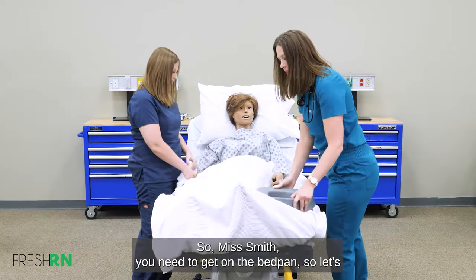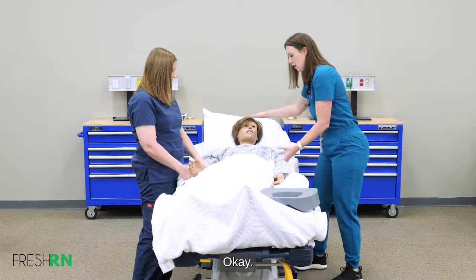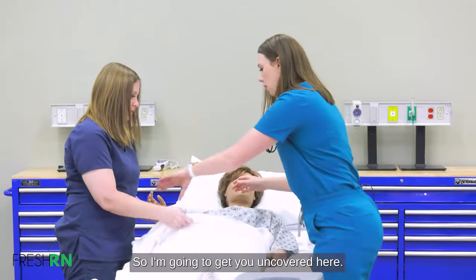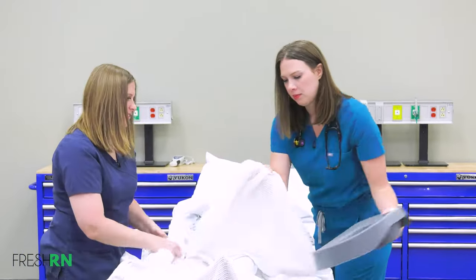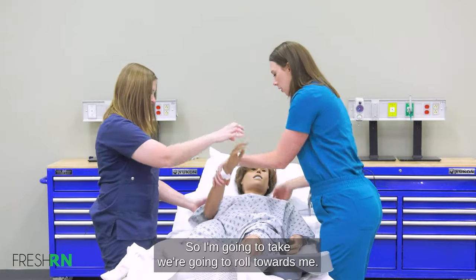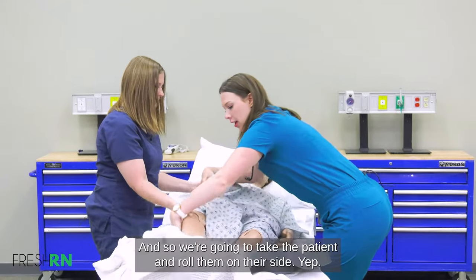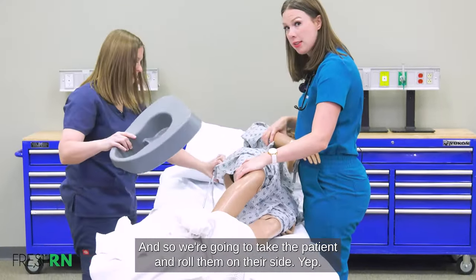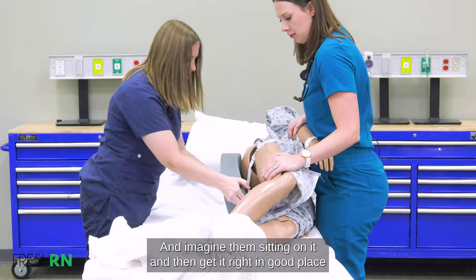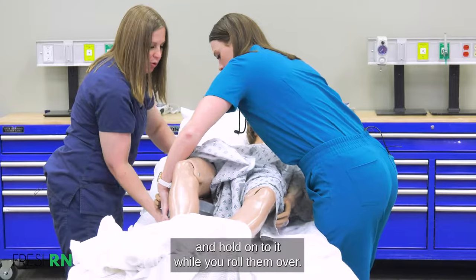Okay Ms. Smith, you need to get on the bedpan, so let's go ahead and put you down a little bit here. Which way do you want to roll? Let's roll towards you. I'm going to get you uncovered. This is a clean bedpan. We're going to roll the patient on their side, put the bedpan right there — imagine them sitting on it like a toilet seat — and get them in a good place, holding on to it while you roll them over.